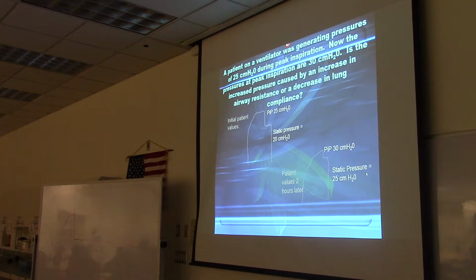Yeah. So when the alveoli get stiff, it's called lung compliance. Just want to make that connection for you. So yes, very good. The pressure went up, but you notice that the static pressure went up also. So that just tells you that the alveoli are getting stiffer, or the lung compliance is getting stiffer. Any questions on that? So if it stays the same, it would be due to the airway? Yes, always. So if the static pressure stays the same but pressures went up, it's always going to be because of airway resistance. Okay. So the static pressure is the same thing as the plateau? Yes, static pressure, plateau pressure, same thing.